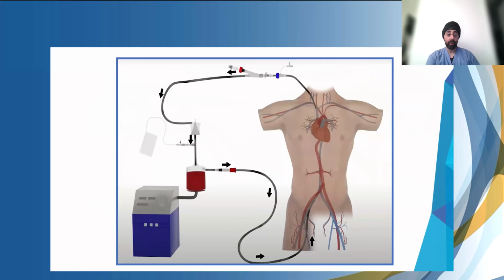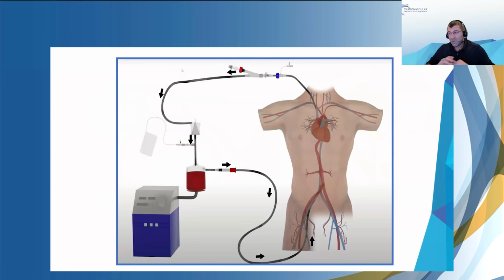I completely agree. This is the setup for the AngioVac that you see on the screen here. Having that continuous aspiration, steerability, plus that return cannula makes it an attractive option for these patients. One thing that always comes up is if you embolize some septic material and the patient becomes hypoxic, what do you do, Sanjam? Do you keep the steer with the AngioVac or do you switch to another device?